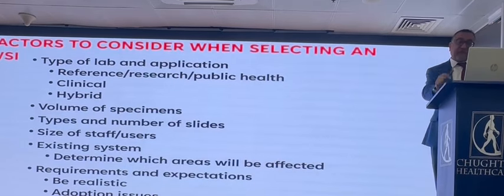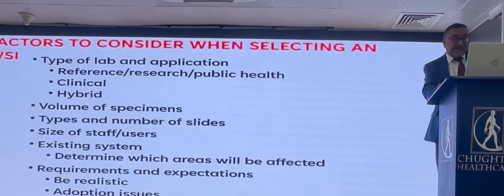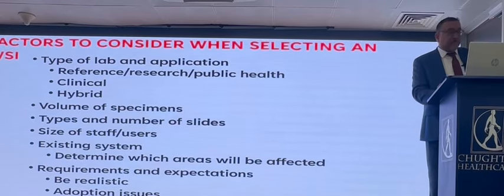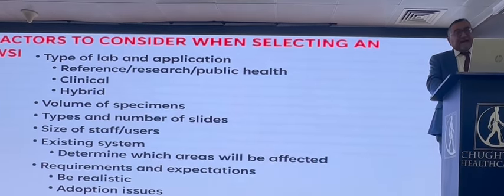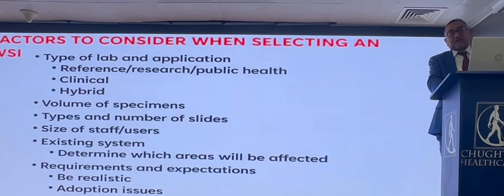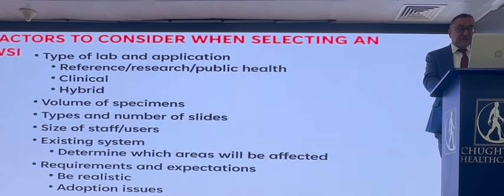So it depends on the type of lab. Is it a reference lab? Is it a research lab? Clinical lab? Hybrid? What are you trying to do? How many slides are you going to scan? What are the types of slides? Are you only doing histology slides? Are you doing cytology slides? Are you doing bone marrows, smears?